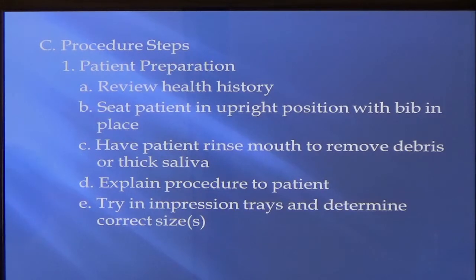Mrs. Smith, we're going to be taking some impressions the doctor needs. I'm going to mix this powder and liquid. I'm going to put it on a tray, and I'm going to put it on your lower jaw or upper jaw. And it takes about 2 minutes to set. It's going to feel a little funny. Just breathe through your nose and wiggle your toes, whatever, and we'll take it out as soon as it sets, okay? And just let them know what to expect.